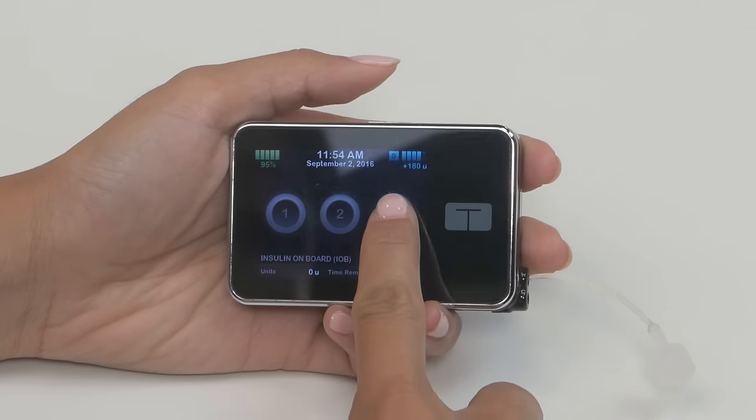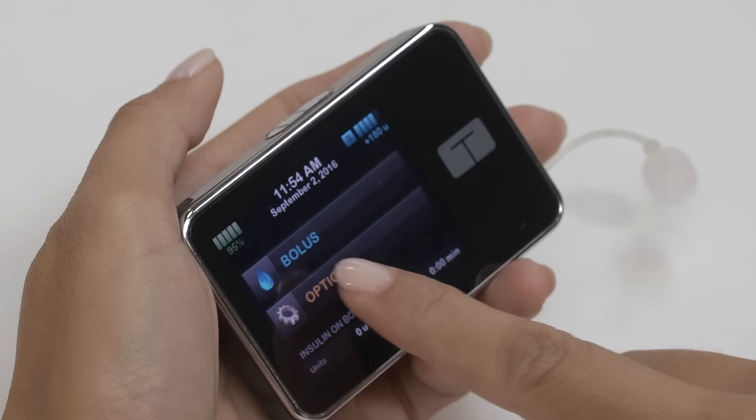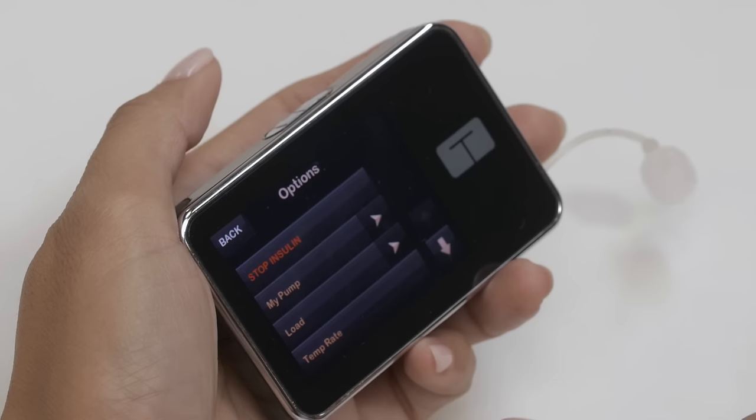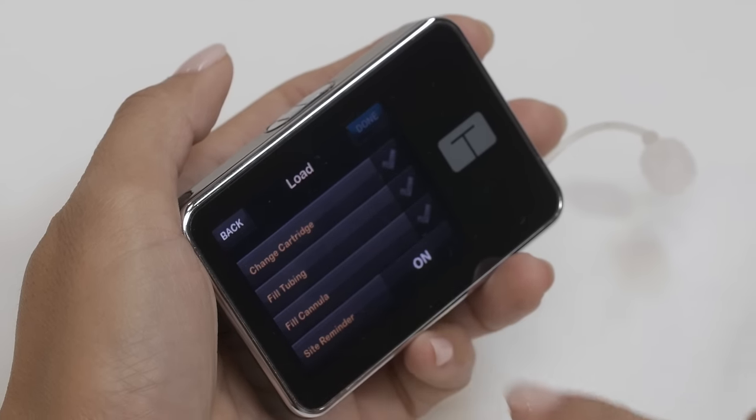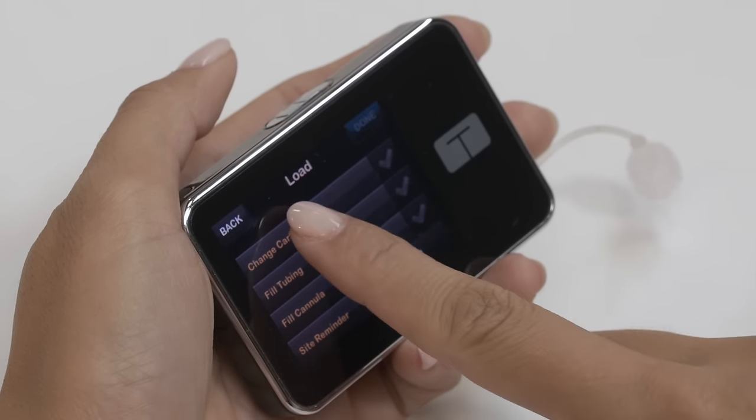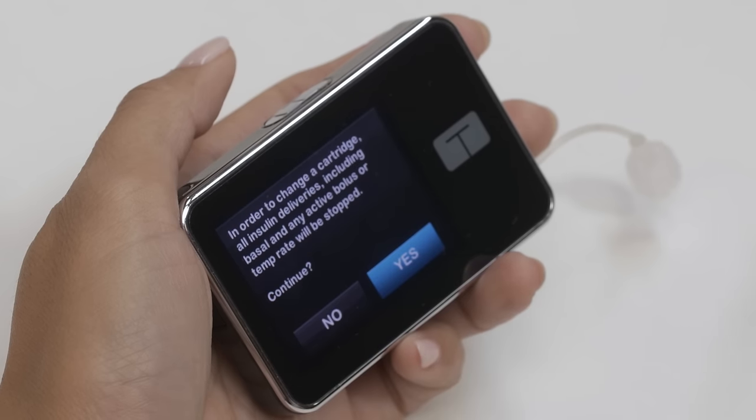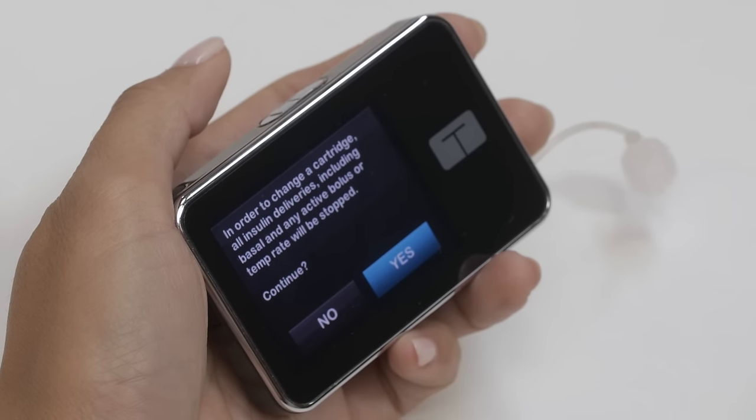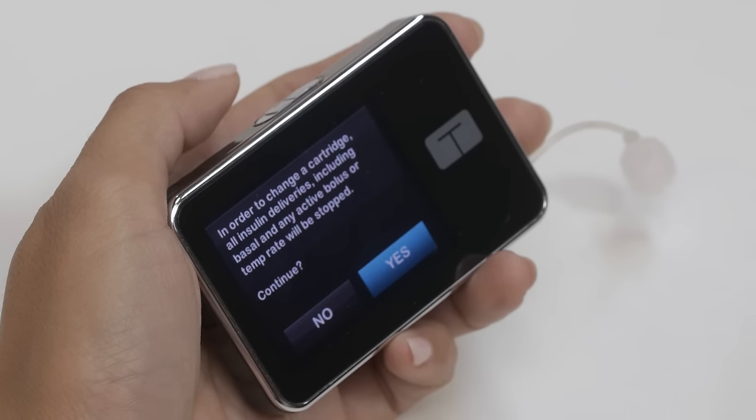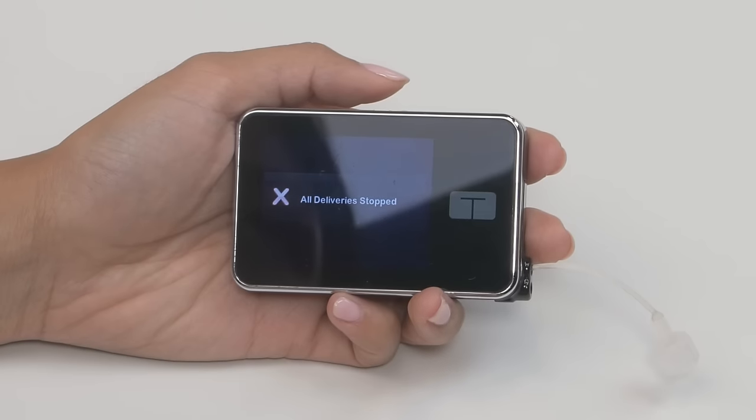Now turn on and unlock your pump and from the home screen tap options, then tap load. Next tap change cartridge. The pump will tell you that all deliveries will be stopped, which is fine since you don't want to be trying to pump while you're changing your cartridge, so tap yes to continue.